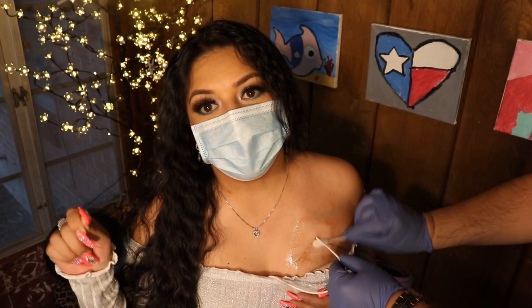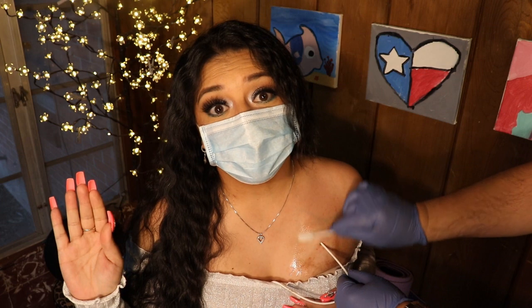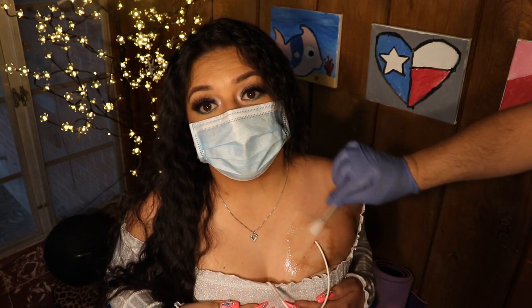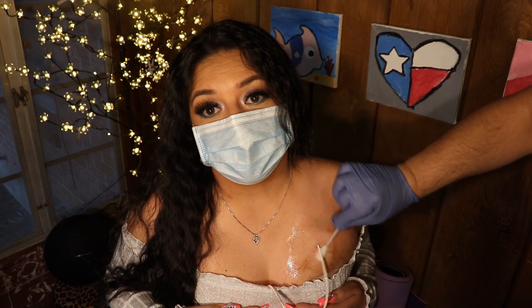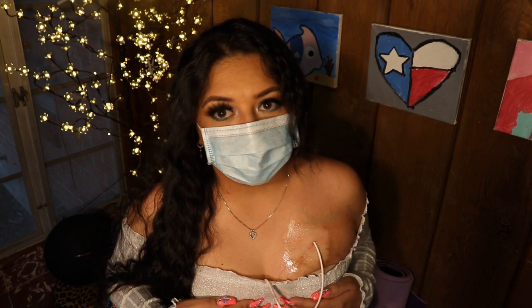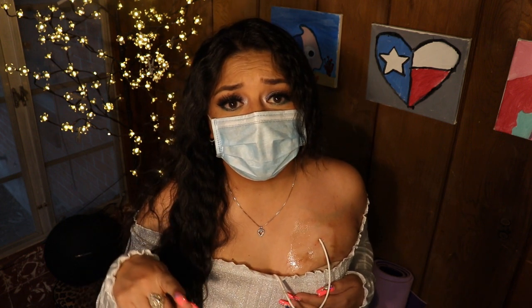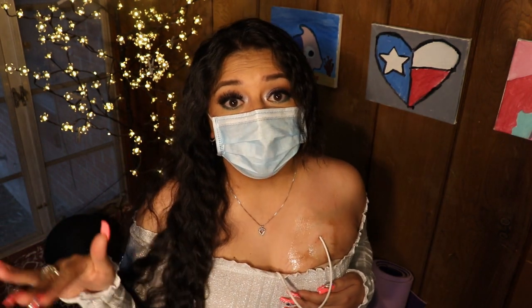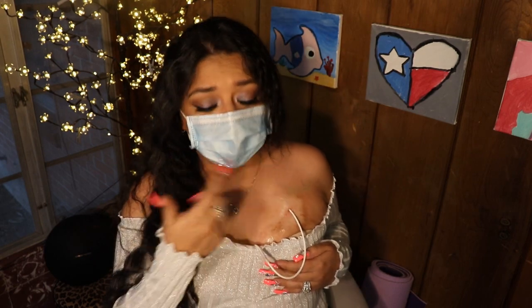You're probably going to have to watch this whole thing through — slowly the wiping. This looks like I'm holding my boob the whole time, but I've got to hold the shirt down because I don't want it to touch anything. Now I'm going to pause it again and start later because, like I said, you have to wait until this dries down completely before you move on to the next step. And you're glad you have this mask on because when you inhale this stuff, it is so strong — sometimes it makes you want to cough. So make sure you have your mask on.